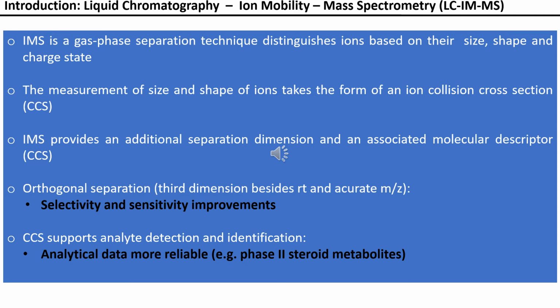Ion mobility offers extra dimension for compound separation, providing a higher peak capacity when it is associated with LC-HRMS. This extra dimension can reduce the noise level and increase the separation efficiency of the analytical method.